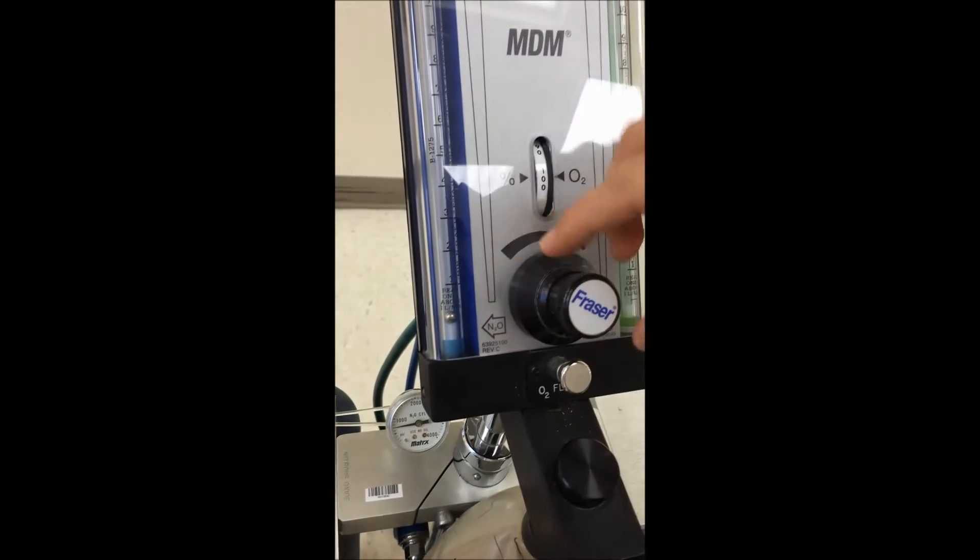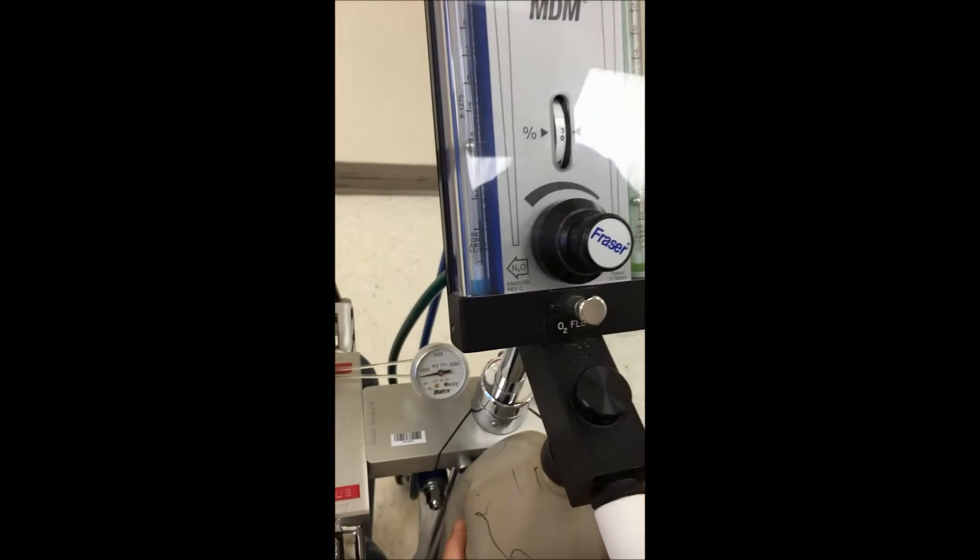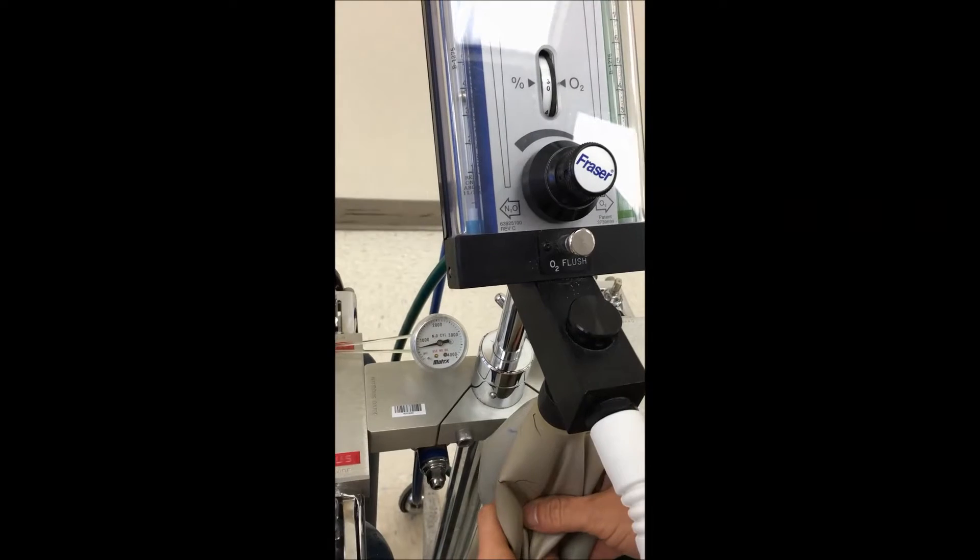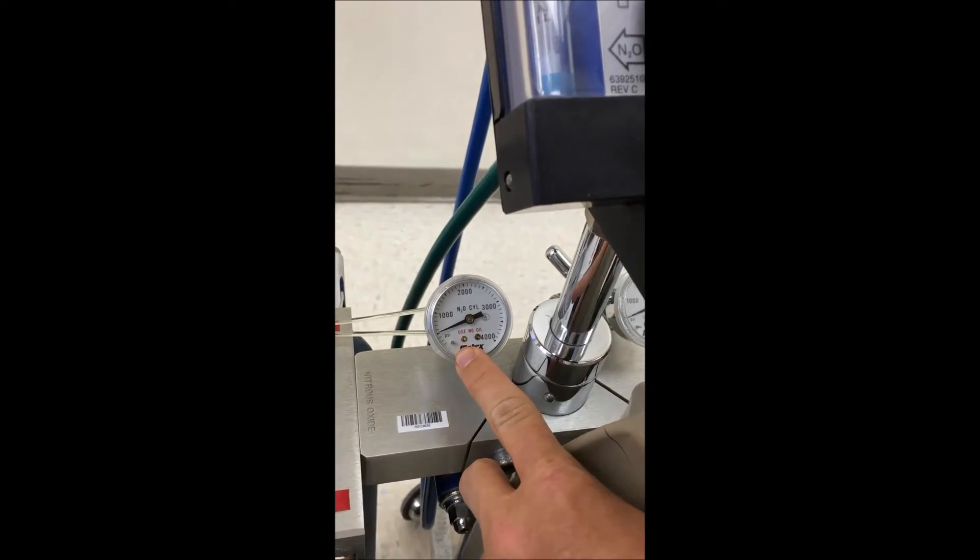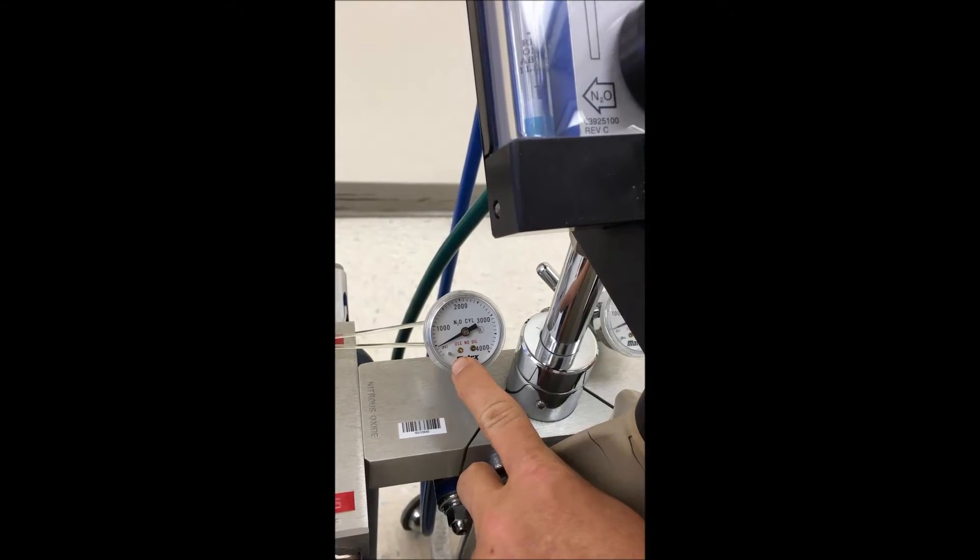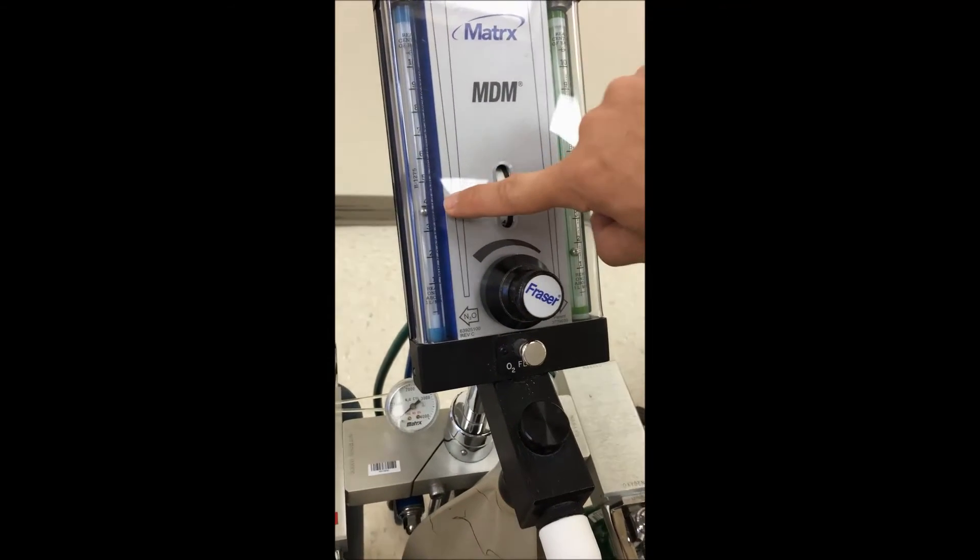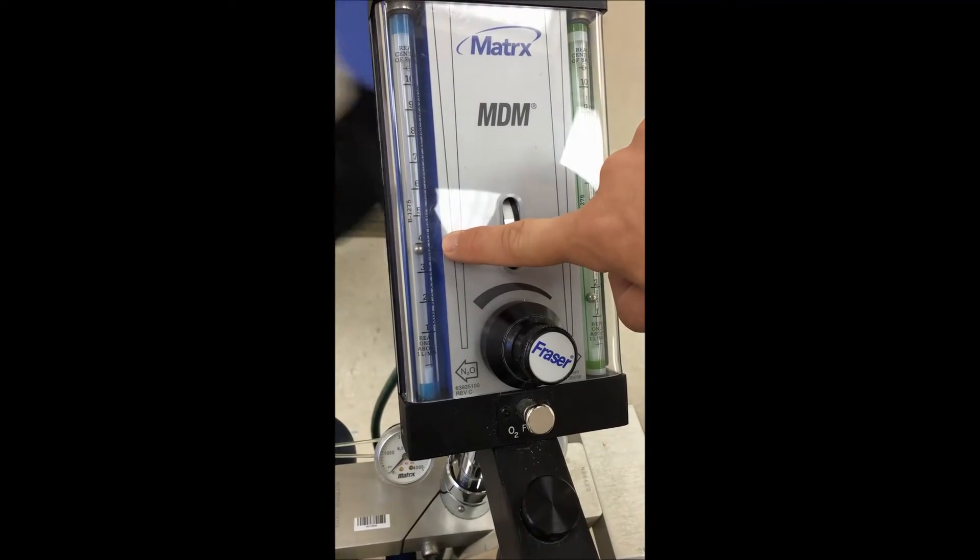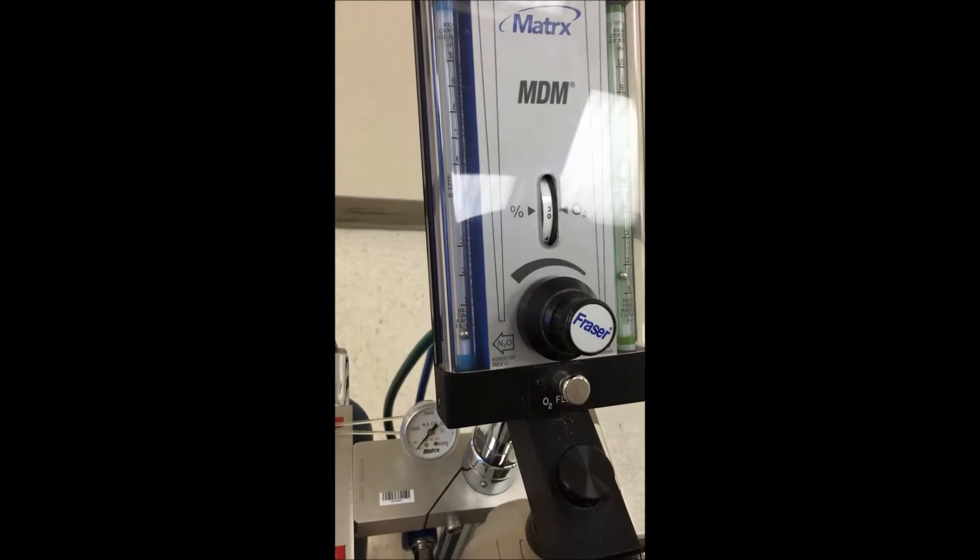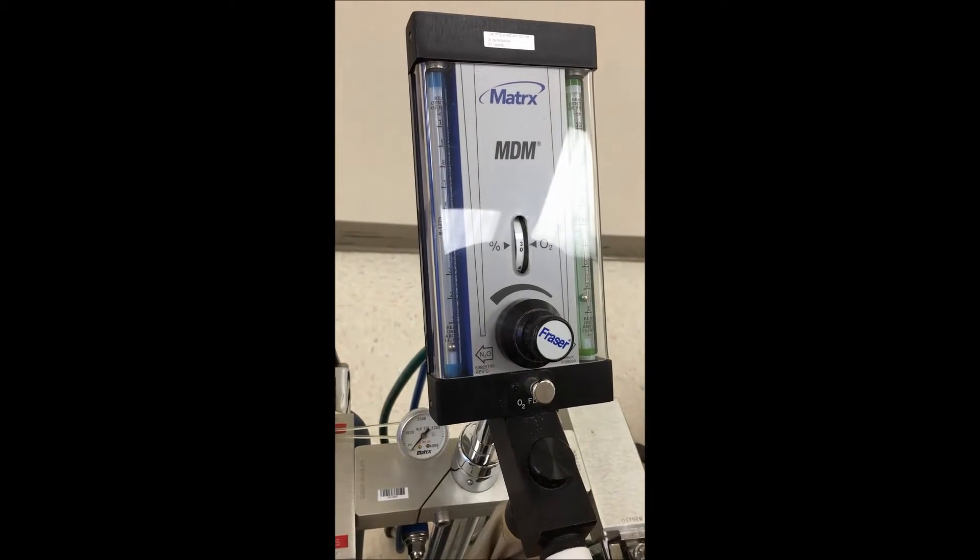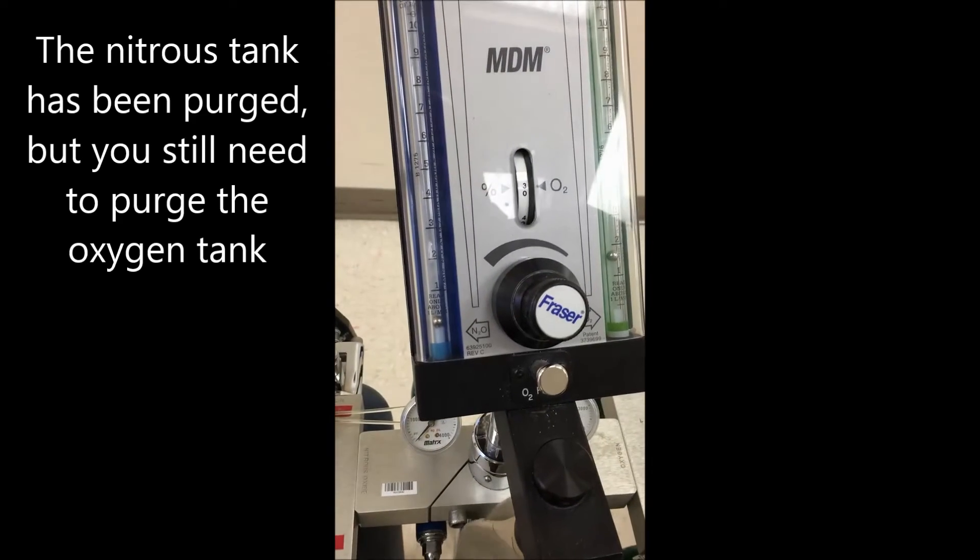We go and we turn up the nitrous. If we squeeze it, it goes a little bit faster, and notice that we're purging that tank and it's going down to zero. Notice when it gets all the way to zero, that ball is going to fall down to nothing. There is no longer any nitrous other than inside the blue tanks.